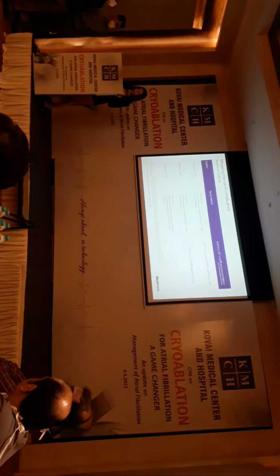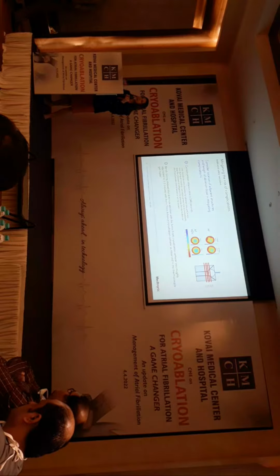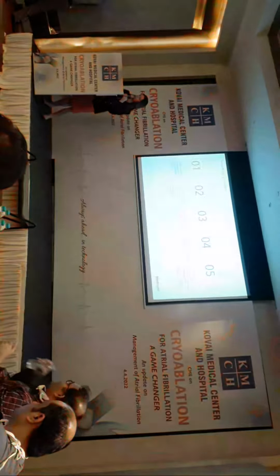there it goes. The team approach for this is absolutely key. There's a new balloon. So, again, the balloon has gone through multiple changes since its release in 2010, early 2011, but the current balloon has more ports for freeze. It's easier to get it in a stable position, and again, this is a huge advantage of the adoption at this stage of the game. We talked about all of those possible procedural risks.